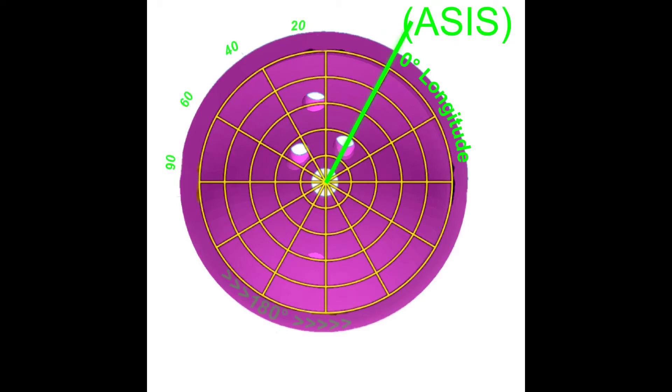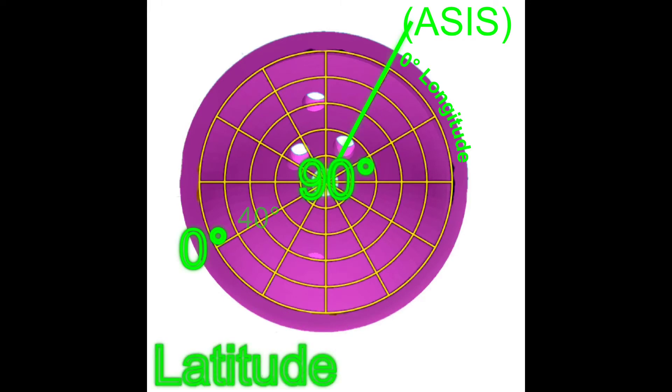Green line shows position of the anterior superior iliac spine (ASIS) where longitude value is 0 degrees. Longitude values between 0 and 360 degrees, latitude values between 0 and 90 degrees. Deepest part of cup pole at 90 degrees.